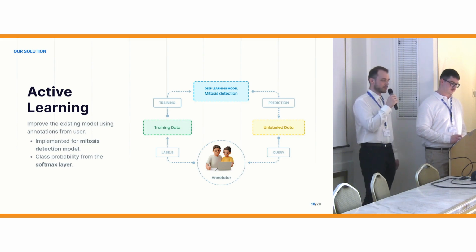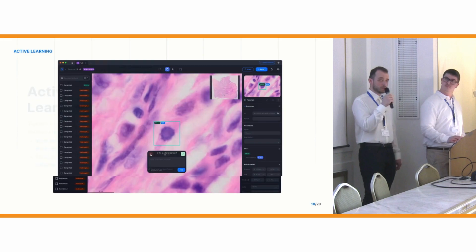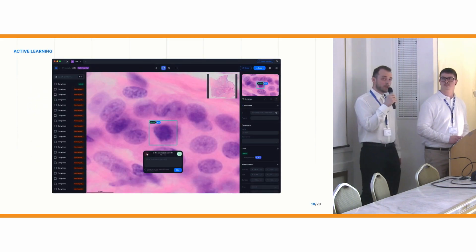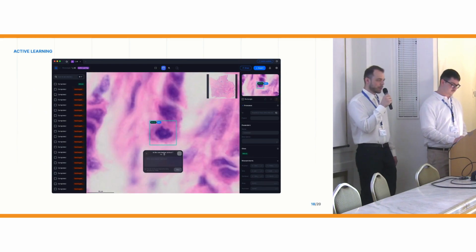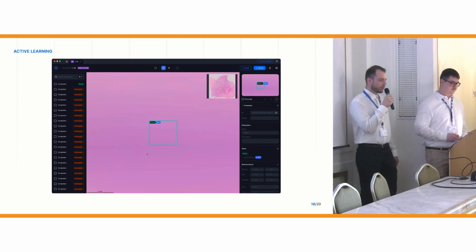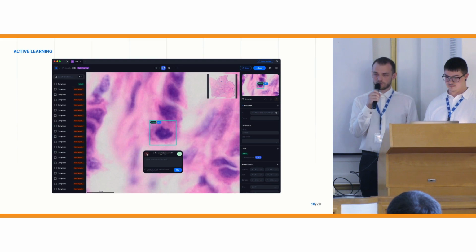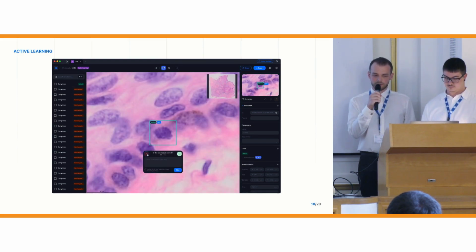The annotation app has a special section called active learning, where the user can select an image of which predictions he wants to repair. The user can mark the prediction as correct, incorrect, or skip it. Additionally, he can provide a message explaining the reason for his choice. The same predictions are shown to all users, which enables us to decide the final label based on the voted majority. We have already done a testing session with medical experts where they had predictions of 200 mitoses, but the results are still not known because the testing was done very recently.